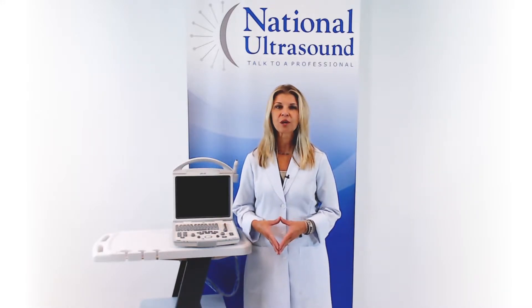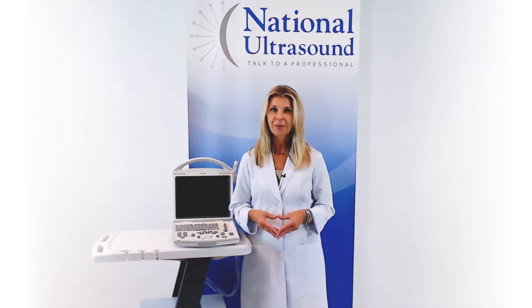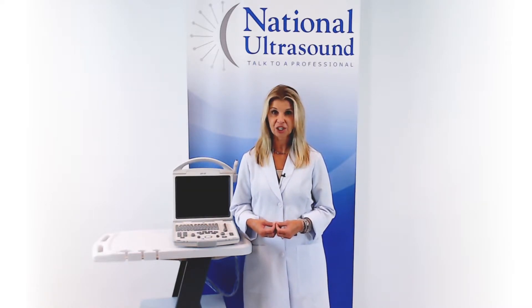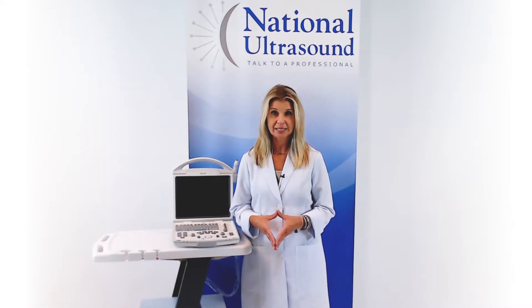Today I am going to give you a quick review on the Mindray DP Black and White Ultrasound machine. The DP20 is the best used machine for general and OBGYN imaging applications for practices with budget constraints. It is the best entry level black and white system in its class.